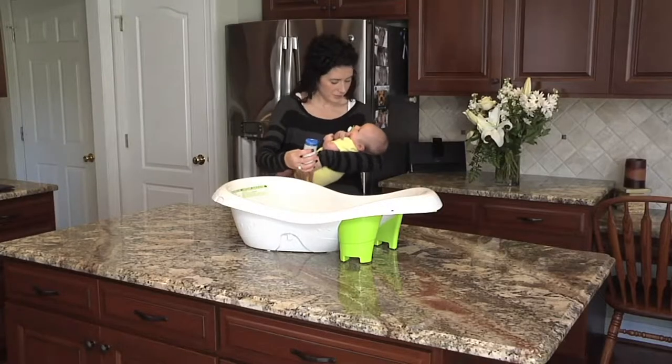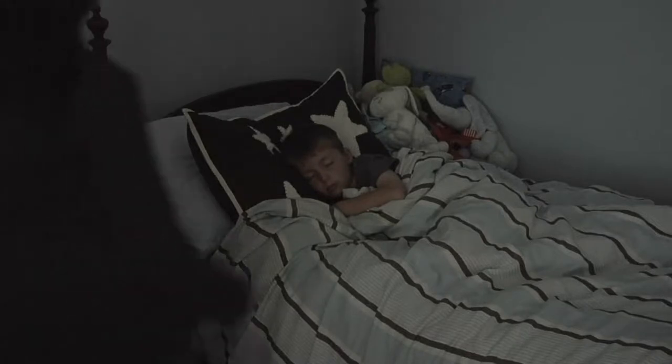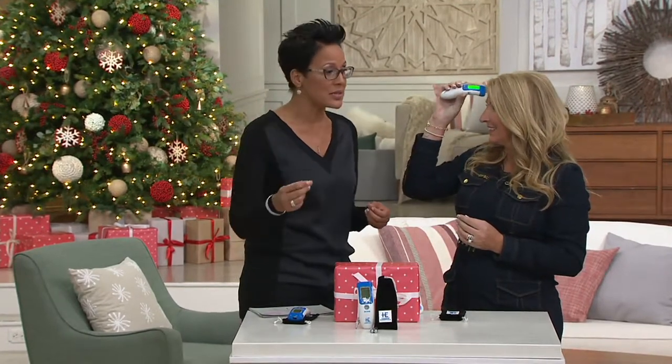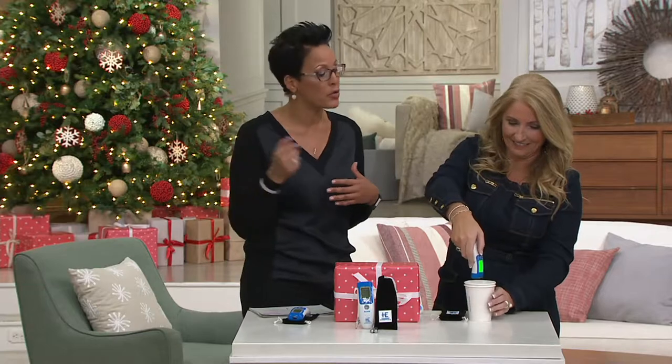You don't even have to read the numbers. If you see green, you know that the temperature is fine. It's customer top rated. It's $29.96, two easy payments of $14.98. And while the video shows taking temperature, it does two other things: is that milk too hot? Is that soup too hot? It can take surface temperature. Is the room too cold for my baby? It can take the room temperature.